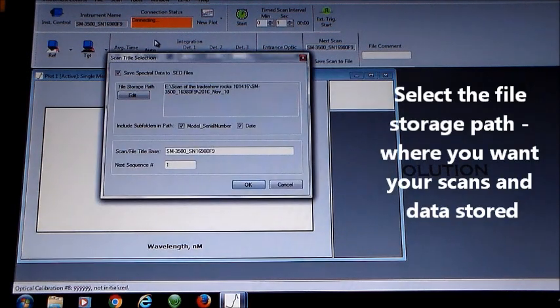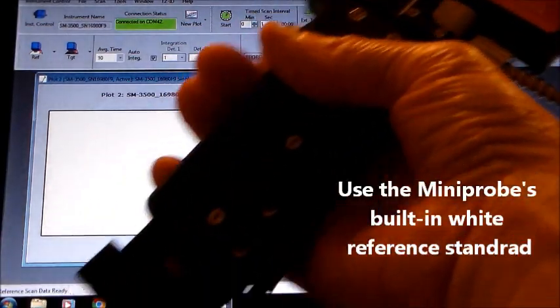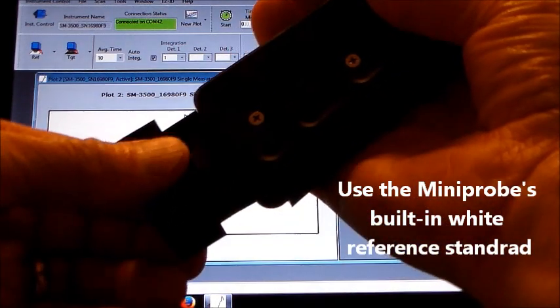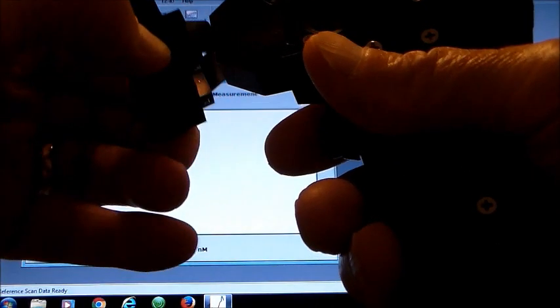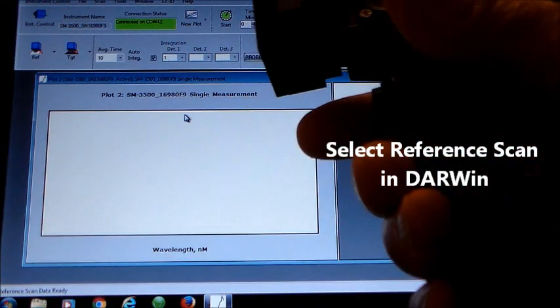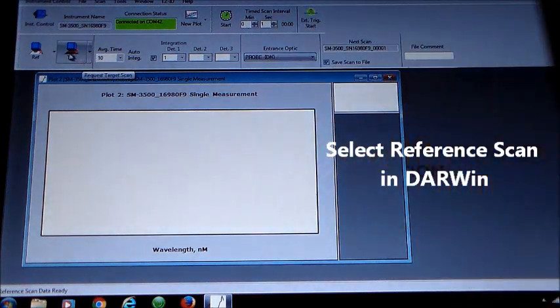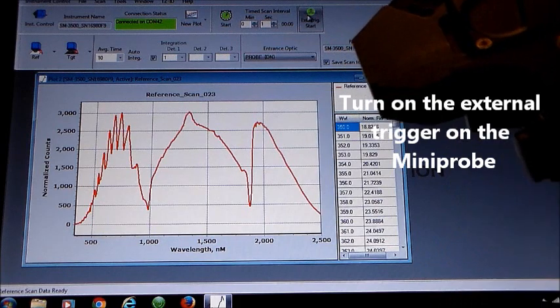Select where you want your scan data stored. Use the mini probe's built-in white reference and select Reference Scan in Darwin. Then turn on the external trigger for your scan data.